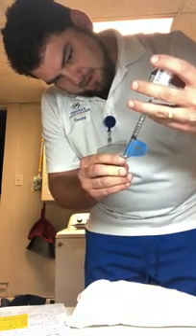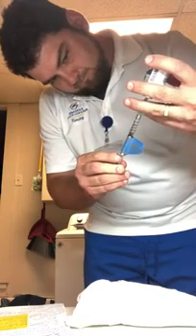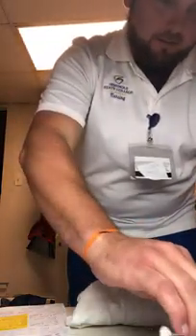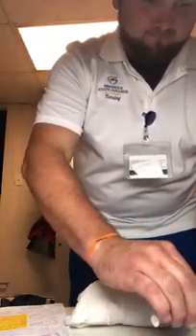So we got that there. Okay, so I'm going to remove that and put that to the side. We'll recap our needle and put that over here.